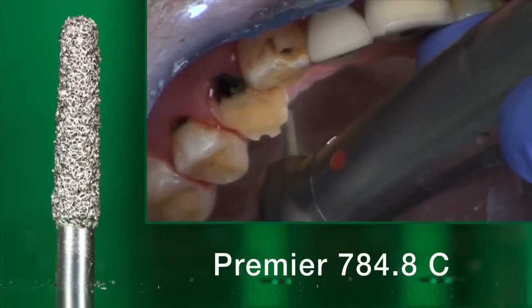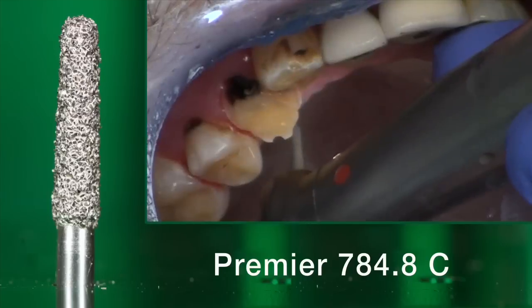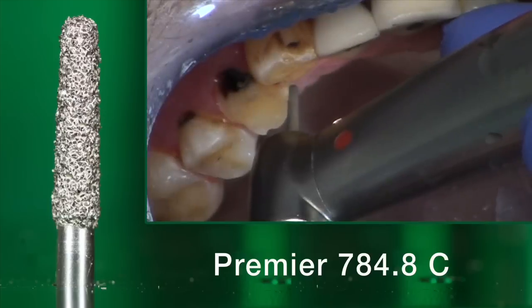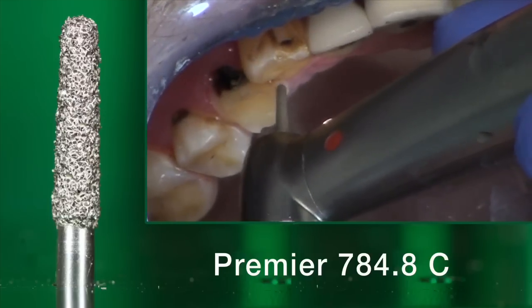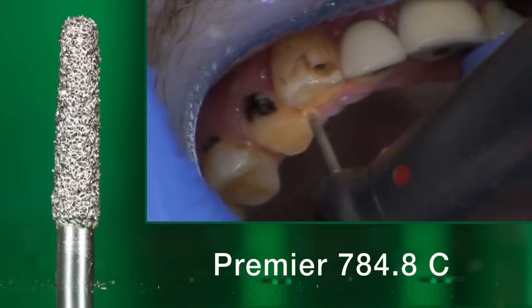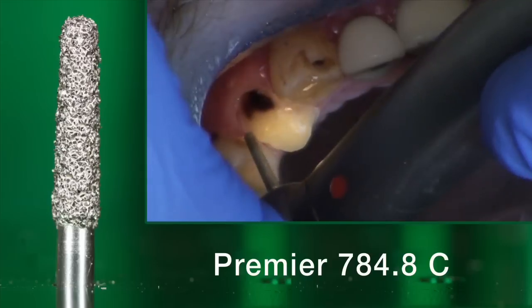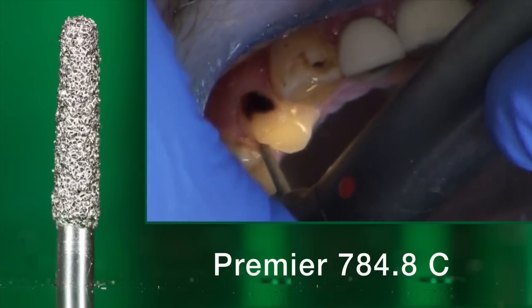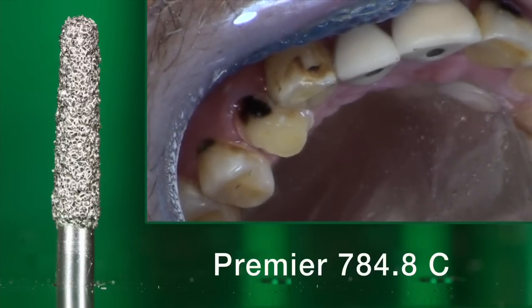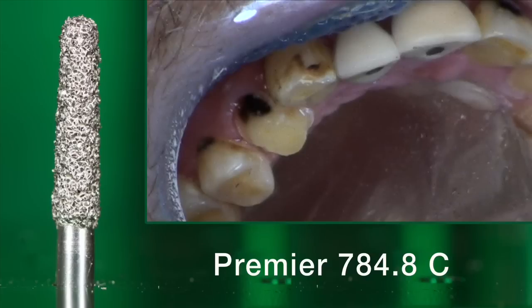I mentioned I'm using a round end tapered burr as opposed to a KR burr. This may be contrary to what you've heard is required for all ceramic restorations. The caveat is we want to be careful not to create a lip at the margin using this round end tapered burr. However, the advantage is that whenever I transition vertically around my prep — such as through the interproximal region — I don't run the risk of creating steps in my margin as I move more gingivally and then more coronally with the tip of the burr. I get a much smoother preparation in the end; I just must be very careful not to create that lip or J margin with the burr.